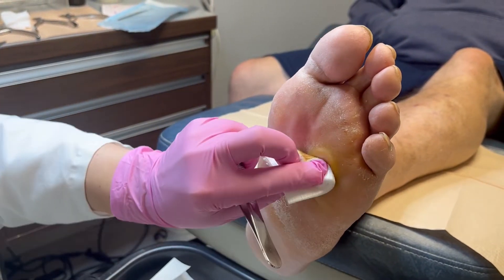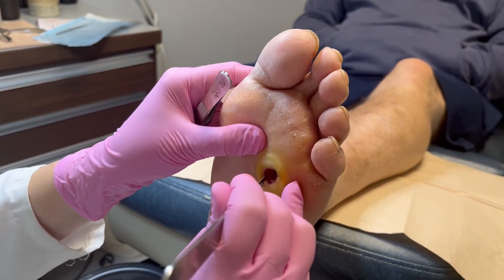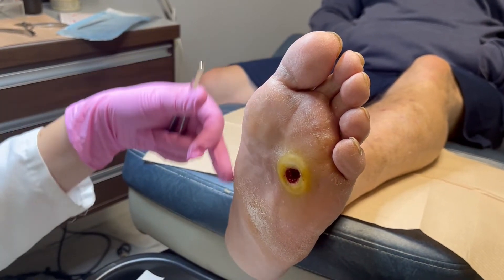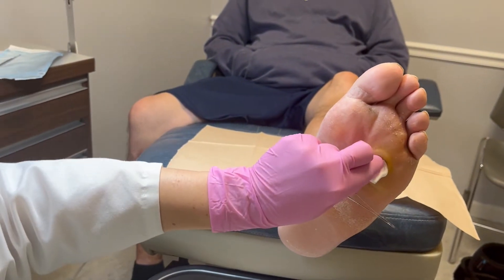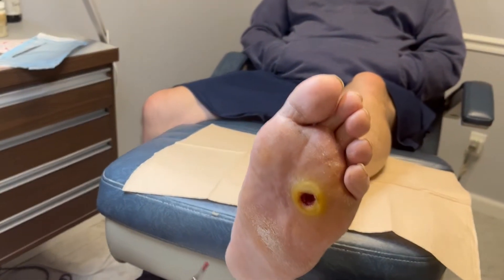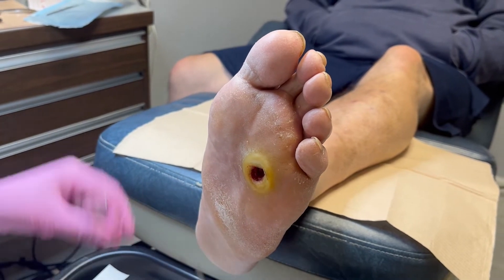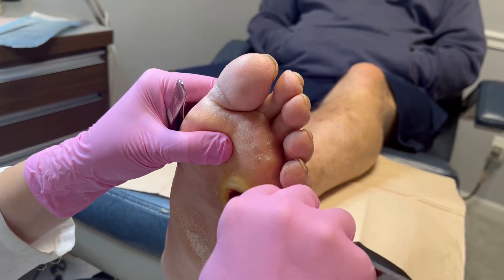He's got excellent blood flow, which is consistent with Charcot patients — they do tend to have very good circulation. As you can see, he has this rocker bottom foot deformity, which is all consistent with Charcot. We got that bleeding nicely. Now the borders of this are hypertrophic, so I do want to bring that down just a bit.